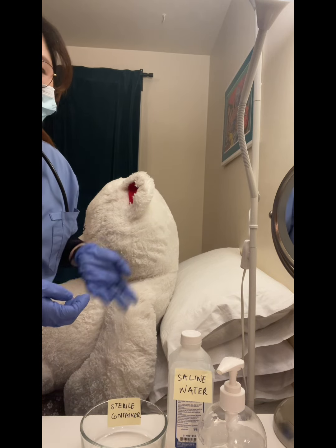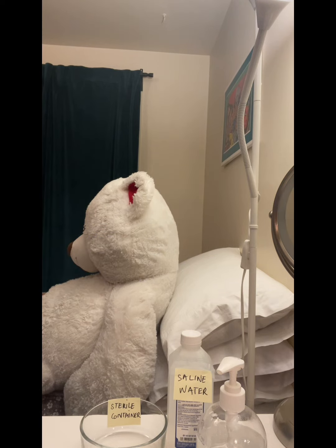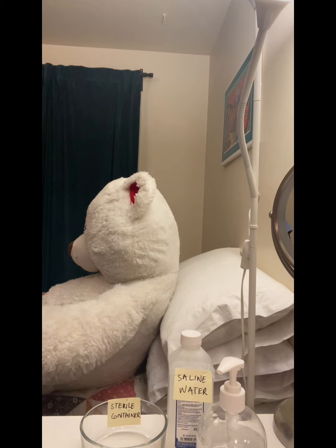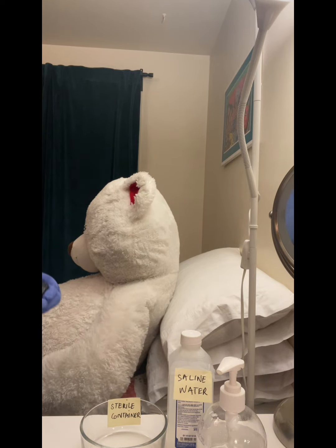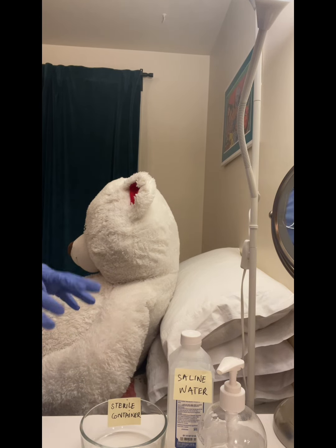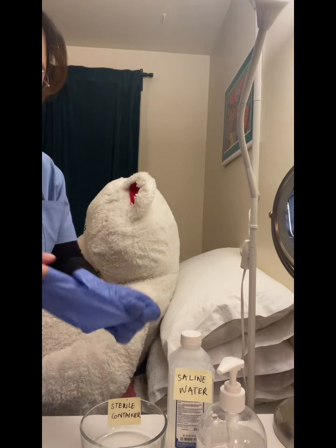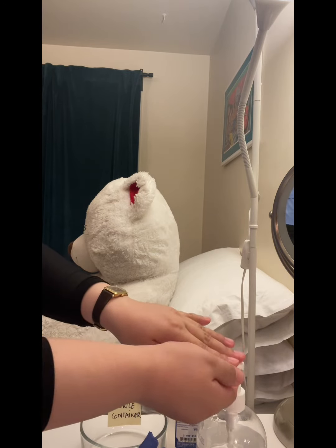And then I will observe the skin color and the oxygen saturation of the patient. And then I will document all the findings. So that is all for the nasopharyngeal suctioning. Then I will perform hand hygiene.